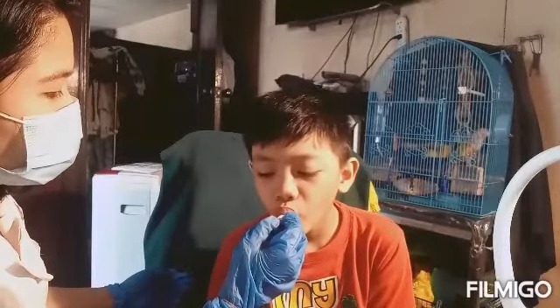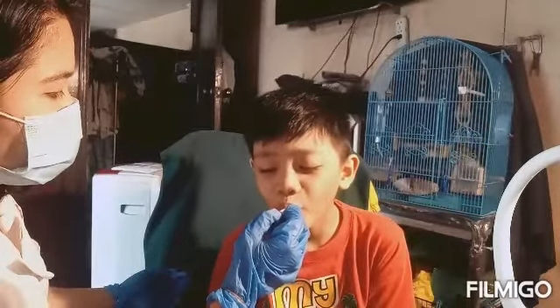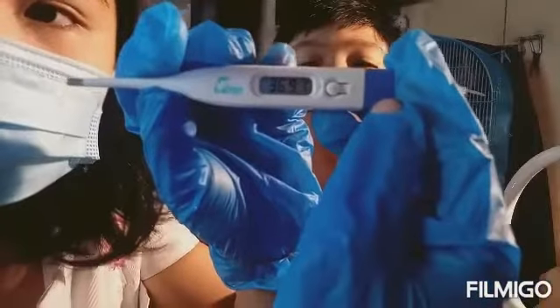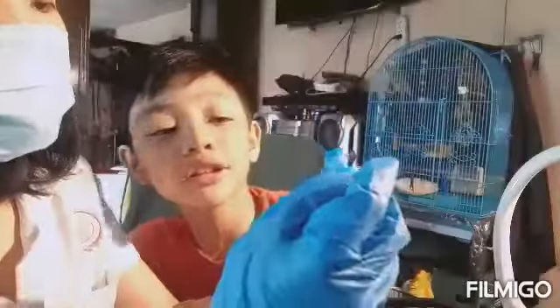We must remember that each child has a normal temperature range that may be different from another child. And now, let's take a look at the result. It is 36.9. It's normal.